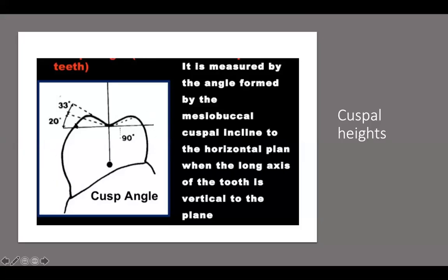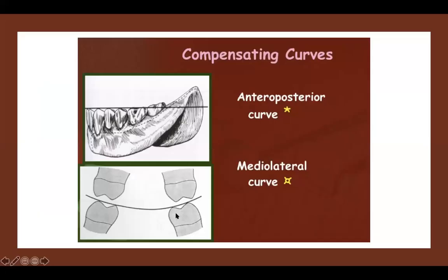So we know by now that the teeth that are available for setting up or making complete dentures come in different ranges. We have anatomic teeth, semi-anatomic teeth, and monoplanar flat occlusal tables, right? Anatomic teeth are mostly of 33 degrees, then we have 30, and then 20 degrees, depending upon the steepness of the cusp. When the angle is getting reduced, we are going towards shallow cuspal occlusion, and then we have 0-degree teeth in which there is no cuspal incline. So depending upon the articular eminence or the indication of the patient, we are going to do the tooth setup.